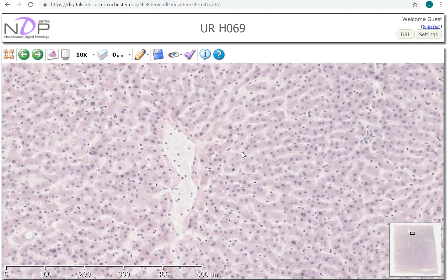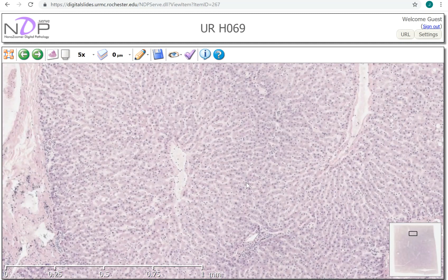Thinking back to the micro-anatomy of the liver: here's a portal tract, and the hepatocytes are going to be divided into zones one, two, and three. Some of these are called periportal and some pericentral, with different names for similar areas. I hope this has been a helpful review of normal liver histology to get you started when thinking about liver pathology.